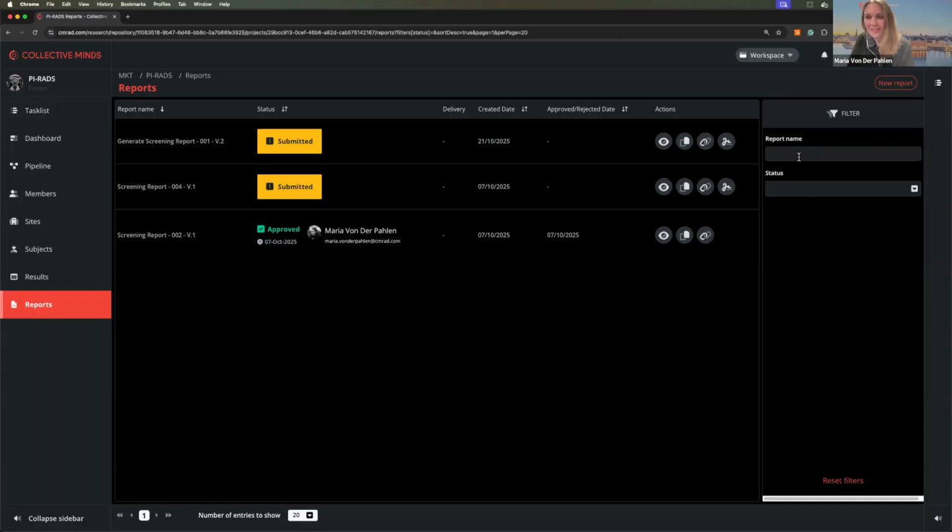I hope you like the small demo, and I will hand over the word back to you, Dan. Thank you, Maria, for walking us through that. I think a lot of users will find this quite intuitive, and especially how it brings sort of key insights together in one place. So over to Ellie.